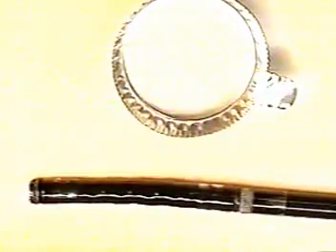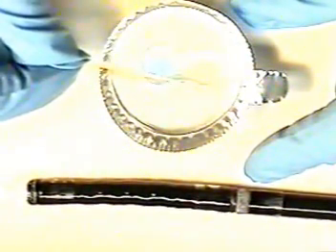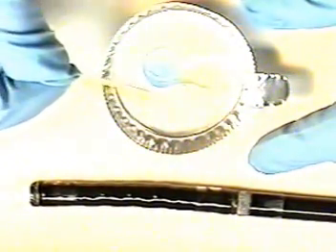We will now mix our bending rubber sheath epoxy. This bending rubber epoxy requires a 1-to-1 ratio when mixing. It is also clear and will require a black pigment. Other epoxies that can be purchased are 2-part epoxy, which requires a 60-to-40 ratio, and you will have to add black pigment, or you can purchase an epoxy which already has the black pigment mixed in with the hardener.